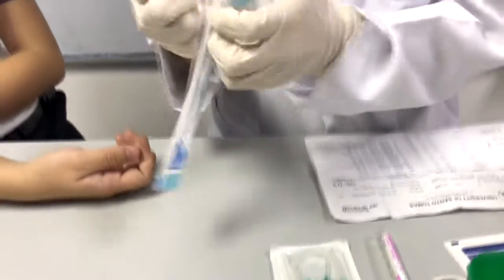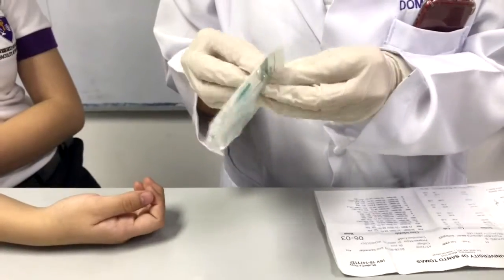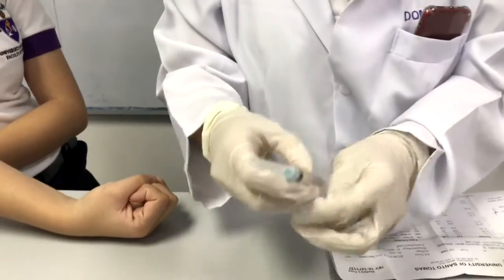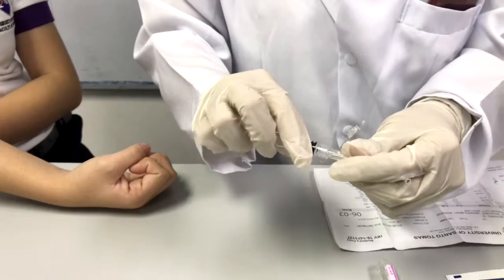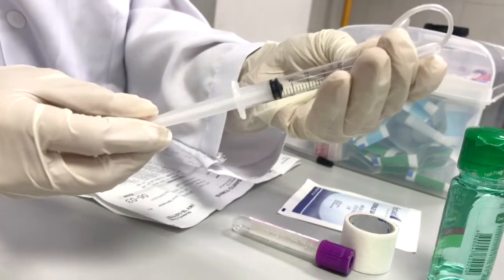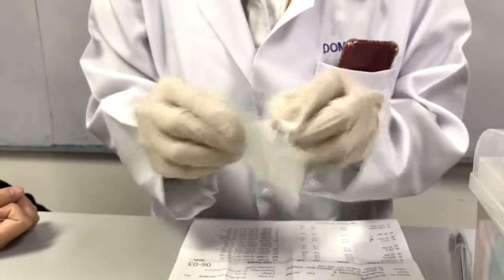Prepare the equipment by removing items from their packages. This is done so that they are ready and easily accessible when you start the venipuncture. Assemble the system by connecting the syringe into the wing infusion set. To check if the equipment is in good condition, pull the syringe back and forth. Make sure your equipment is easy to reach and sterility is not affected.